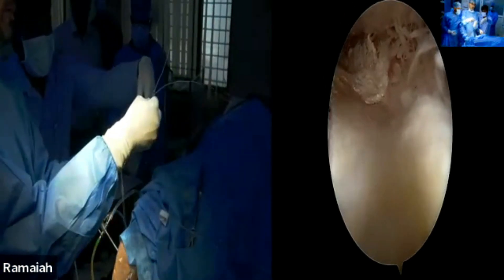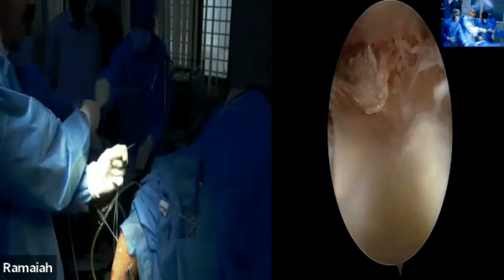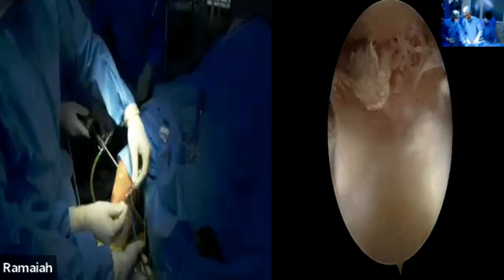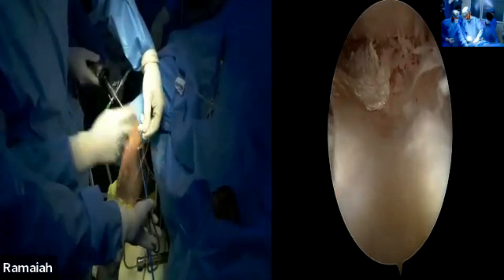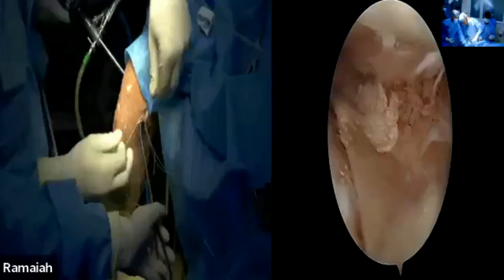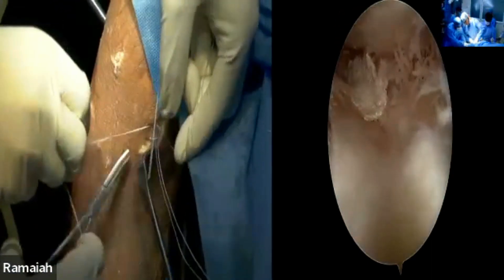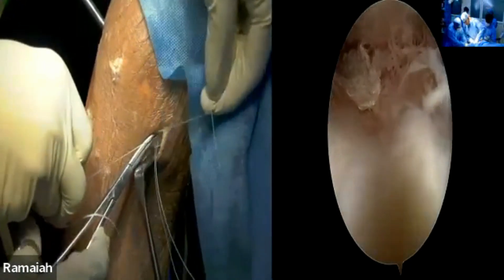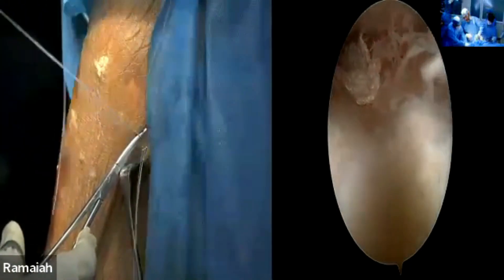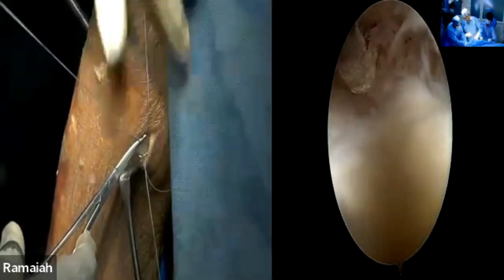The main worry in all inside-out meniscus repair is trapping tissues in between — that has to be cleared. You usually make about a two to three centimeter incision, which is comfortable. You are not on the nerve. Inside-out repair is actually what we can almost call the gold standard.